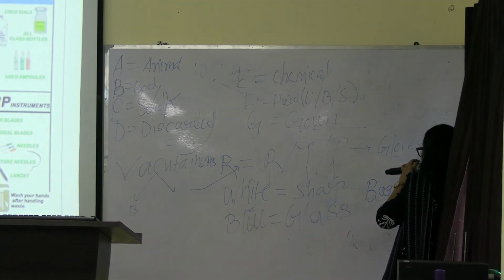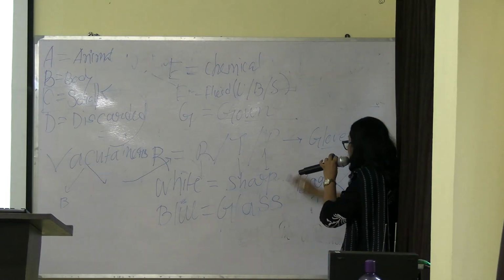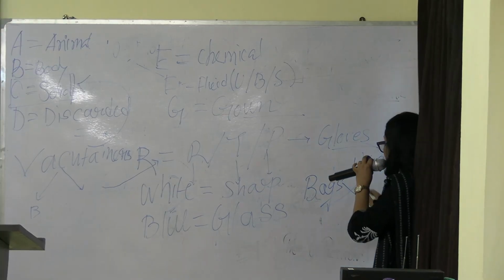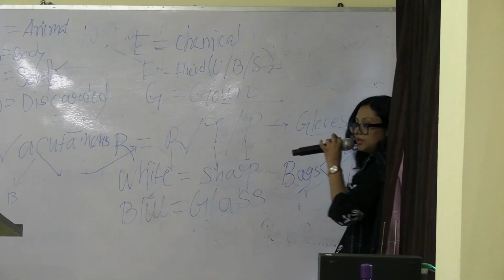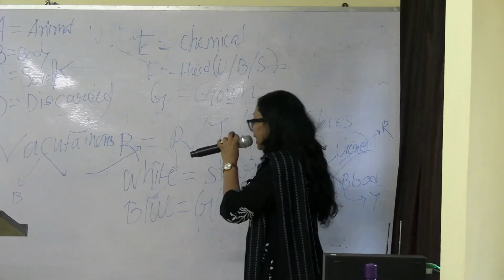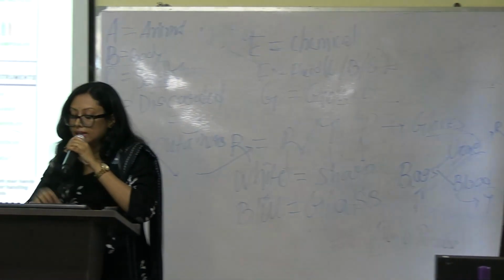यूरिन का कलर क्या होता है? येलो. तो यूरिन बैग जाएगा रेड कैटेगरी में, ठीक है? नाउ ब्लड का कलर क्या होता है? तो ब्लड बैग जाएगा येलो कैटेगरी में, ठीक है? सो यू रिमेंबर दिस वन, यू रिमेंबर RTP, वाइट एंड ब्लू, एंड दिस क्रॉस mnemonic, ठीक है?